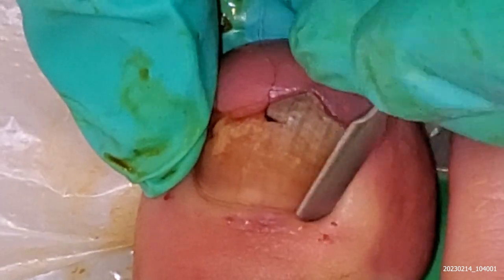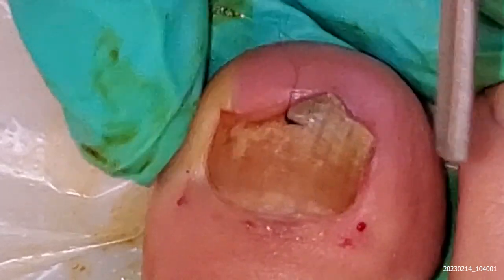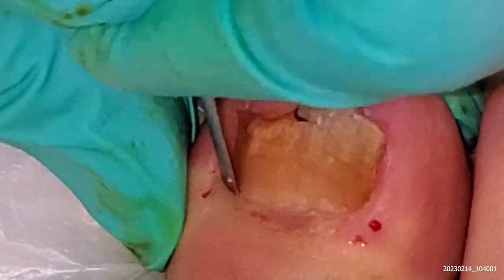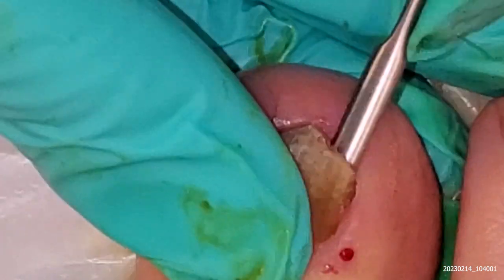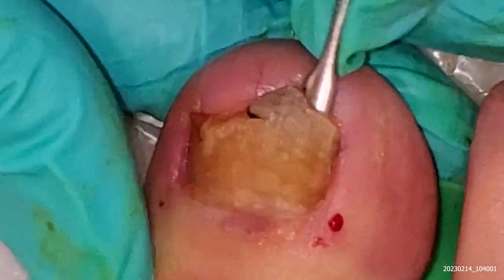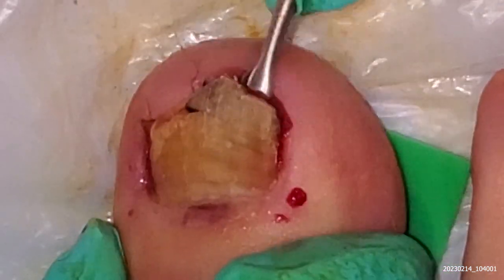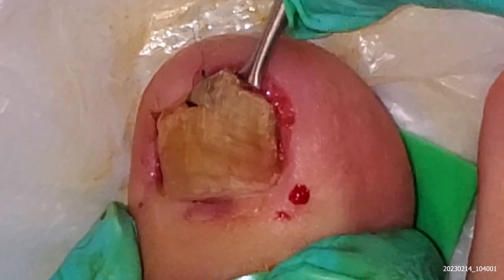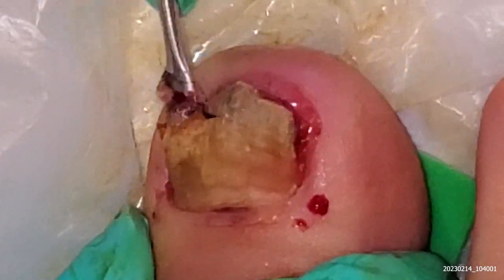I'm using the elevator now, popping along, just moving it from the nail root, loosening it up. I'm going to put the elevator underneath the nail and very gently loosen it — it's quite stuck here. You can see the elevator is in the nail groove.